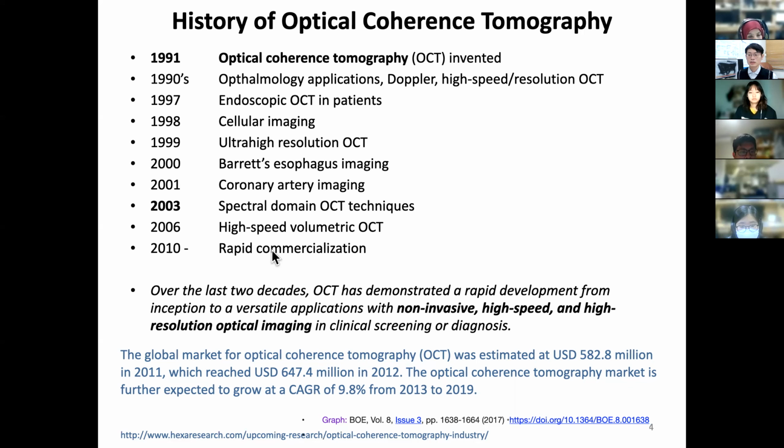So over the last, I think now it's three decades, OCT demonstrated rapid development from inception, you know, the idea is very simple in fact, to versatile application. And why? Because it provides non-invasive, super high-speed, and high-resolution optical imaging, so that it can be useful for clinical screening or disease diagnosis.